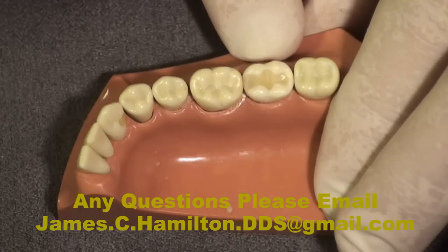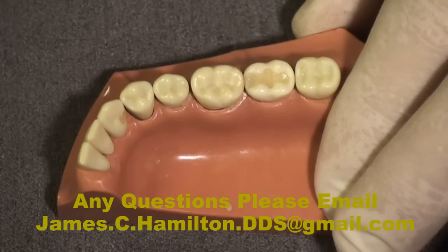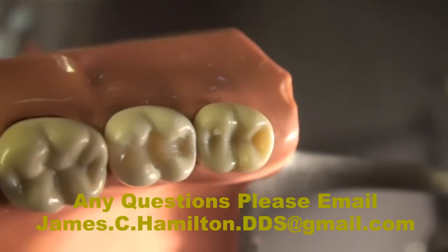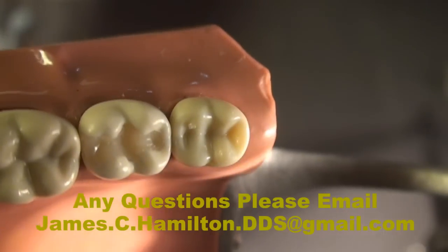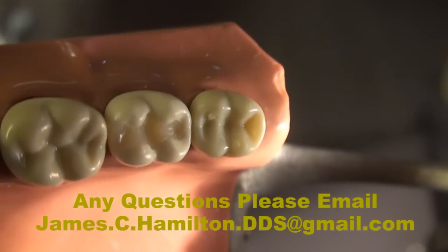Can you imagine placing a posterior composite and after light curing there is no finishing, adjusting, shaping, or polishing? Hard to believe, isn't it? I'm going to try to give you a close-up view — imagine achieving this type of surface anatomy, occlusion, and surface texture.